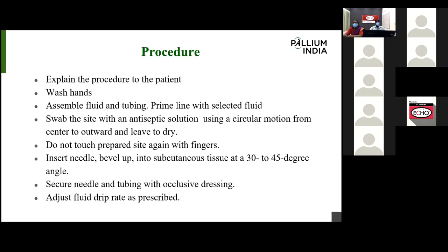Then wash hands, hand washing is a must. Then assemble the fluid and tubing. Whichever fluid or medicine we need to give, we need to assemble that fluid and tubing. Then we need to choose the area. After choosing the area, we need to clean that area with an antiseptic solution swab, using a circular motion from the center outward over the selected area. Then leave it to dry for a maximum of 2 minutes. After cleaning the area, never touch it again with bare hands.